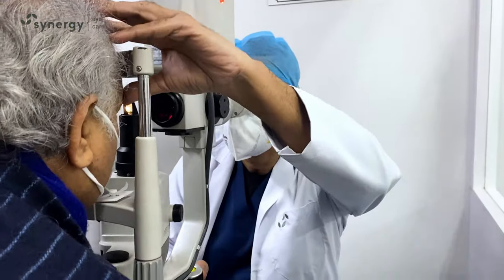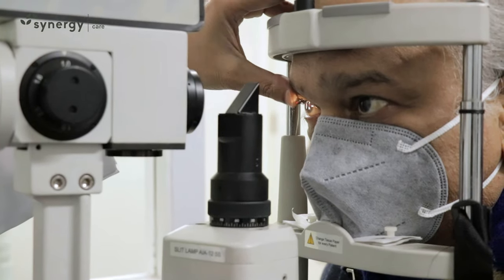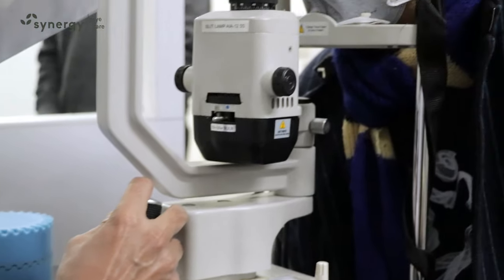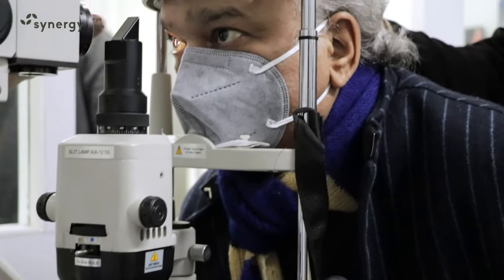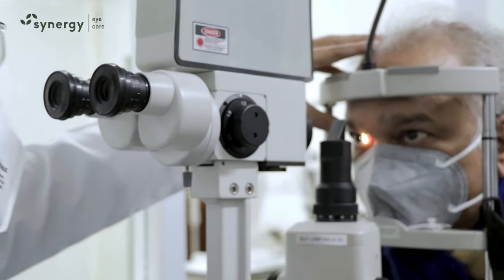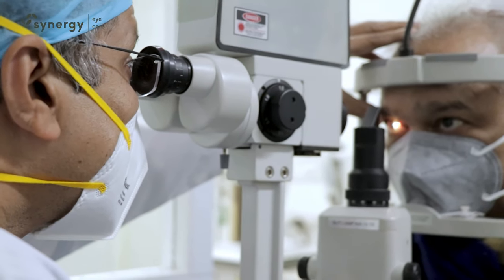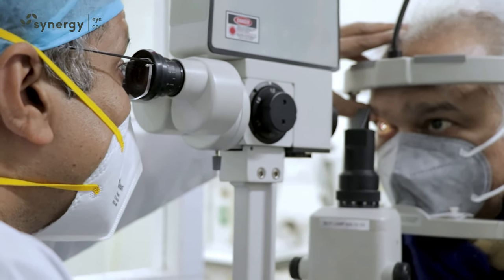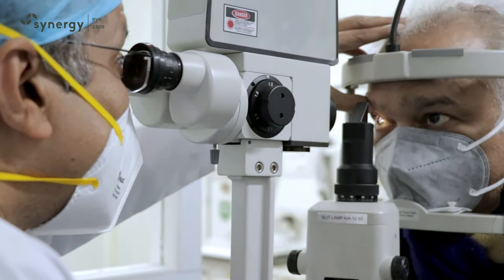In this procedure, a ray of laser beam is focused on the opaque capsule and shots are fired, which breaks open the membrane, removing the blockage in the path of light. This is a painless procedure and the improvement in vision after the procedure is almost immediate.